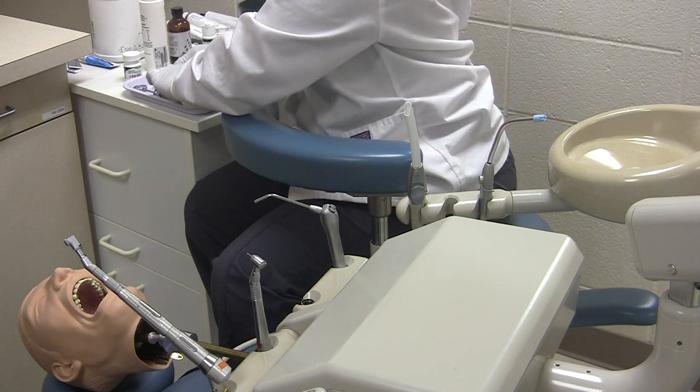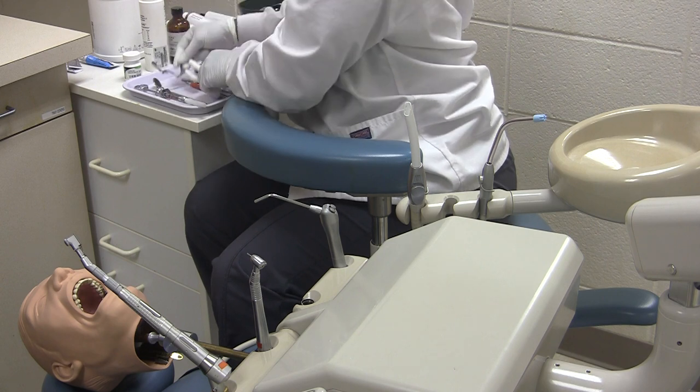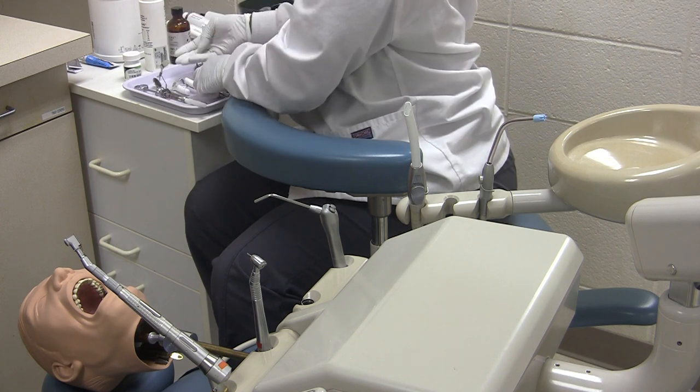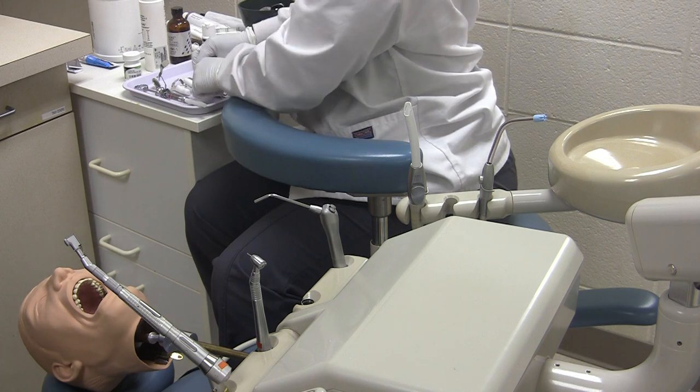Then you would document in your chart. Make sure you document all materials used. That would conclude the crown and bridge procedure for the first appointment.